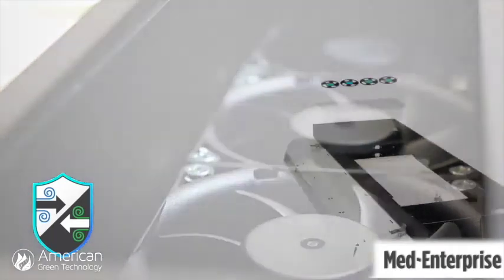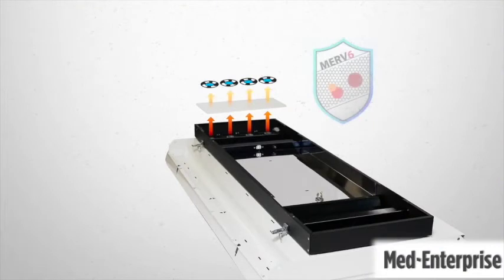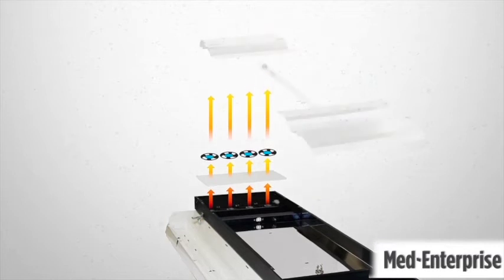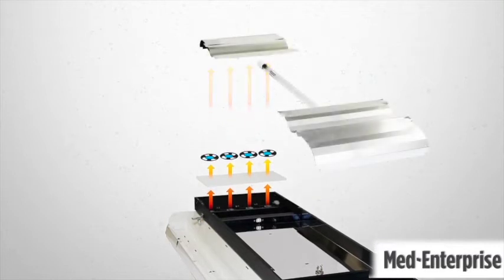We draw the air through a MERV filter which removes larger particulates of dust. This filter is designed to keep the UV lamp operating at peak energy emission and is not designed to trap pathogens. We want the pathogens to flow through the filter and on to the next stage of our system, then forcing the air at 50 cubic feet per minute into the radiation chamber mounted on the back of the fixture.